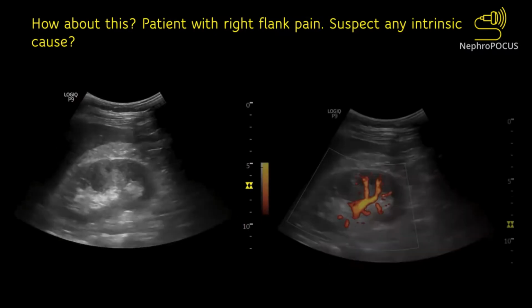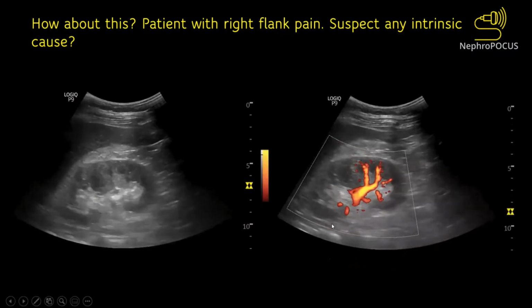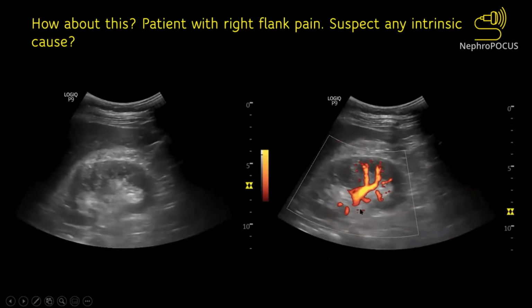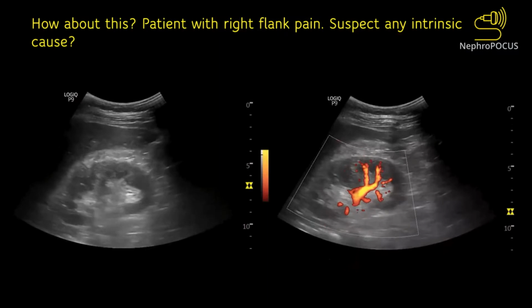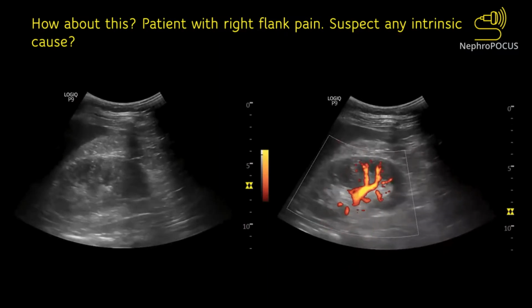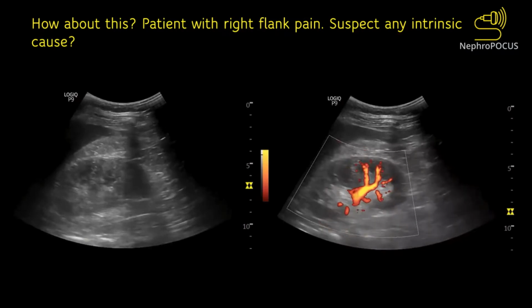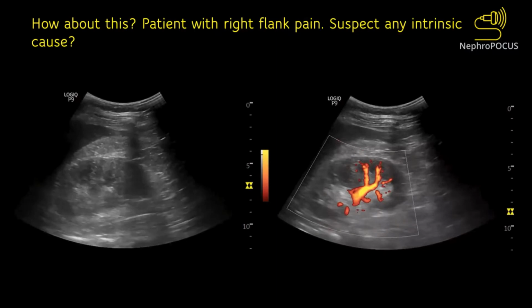Doppler image. So the color Doppler image shows this spectacular pattern where there was blood flow only to one part of the kidney, and the top portion of the kidney is completely bloodless. And the CT scan eventually showed a massive renal infarction. I mean, it's strange that we couldn't find any cause of renal infarction despite doing angiogram and all the hypercoagulable workup and all that stuff.